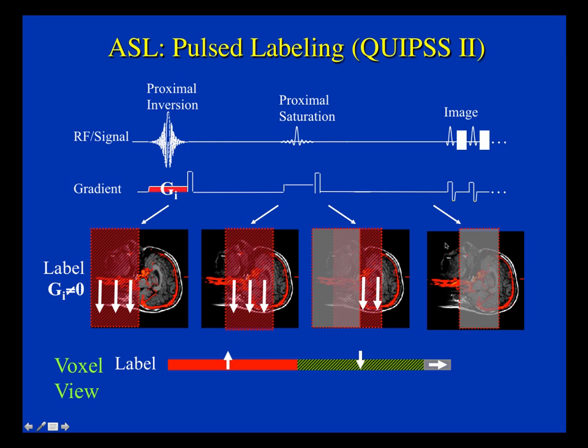So in the next time period, this blood that has been inverted arrives at the tissue voxel and will exchange with tissue or will be present in the tissue. It is instructive to see what the status of the blood is during this pulse sequence at the voxel level.